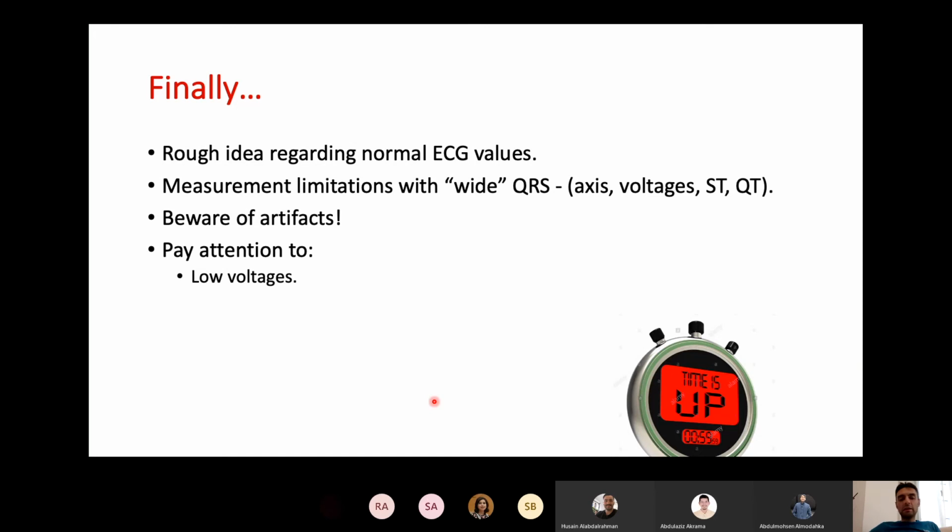Okay. I get so many phone calls about a patient with right bundle and ST segment elevation, but usually when you have right bundle branch block, your ST segment would change, and then it's difficult to interpret that ST segment elevation as being ischemic. Okay, so you have to rule out ischemia by other means, like for example, CT, echo, good history, labs, and stuff. Okay, and so forth for QT and everything else.